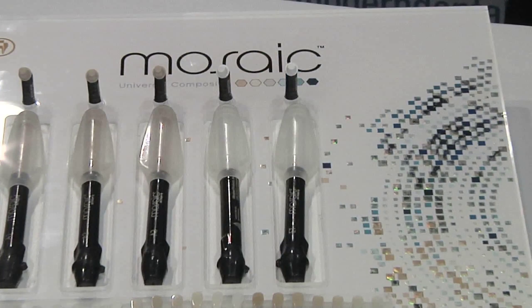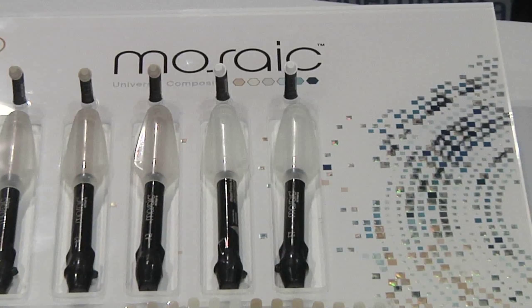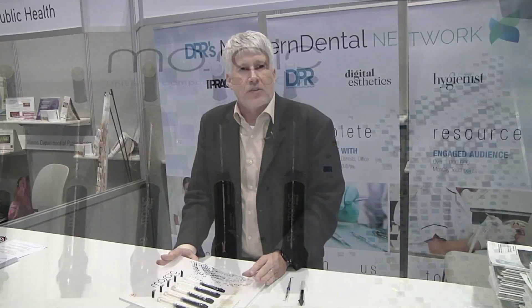This is a product that is really exciting because it's been in development for about five years, and Ultradent was just absolutely adamant about not releasing it until they had all the bells and whistles exactly the way they wanted it. And it's a great material for all aspects of the mouth.